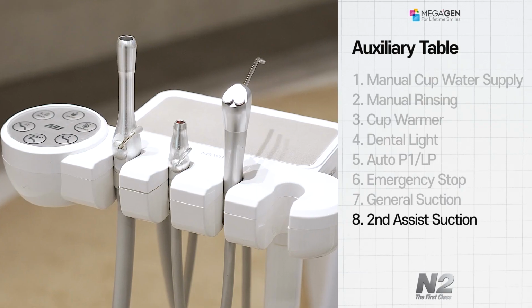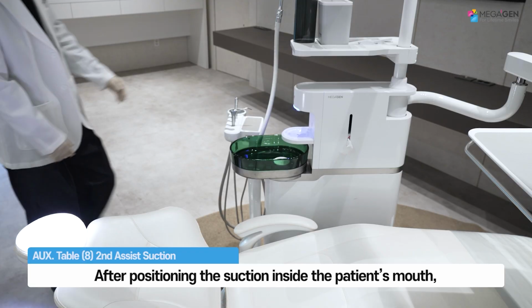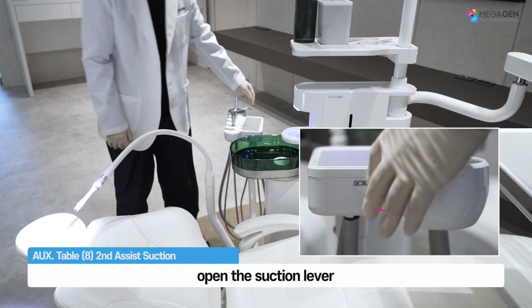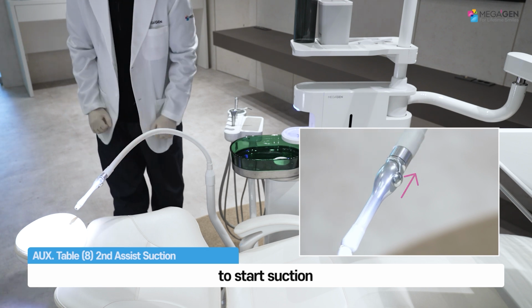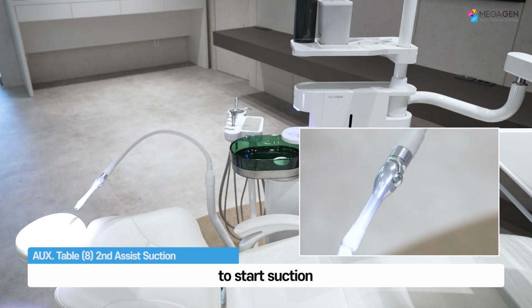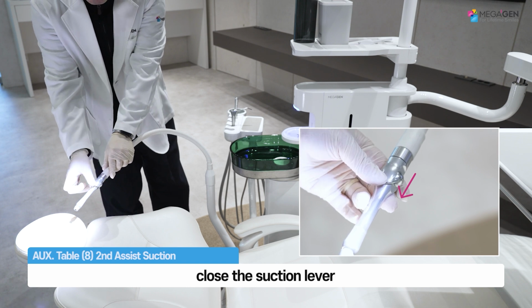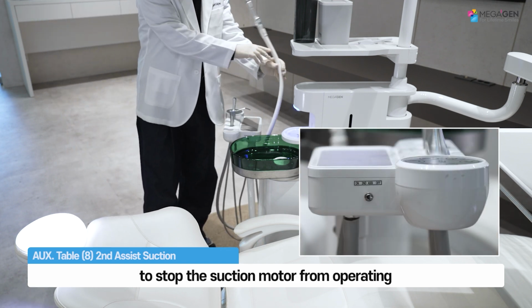How to use the second assist suction. The second assist suction is an optional feature with a flexible hose. After positioning the suction inside the patient's mouth, open the suction lever and turn on the toggle switch located on the outside of the assistant table to start suction. When the procedure is finished, close the suction lever and make sure to turn off the toggle switch to stop the suction motor from operating.